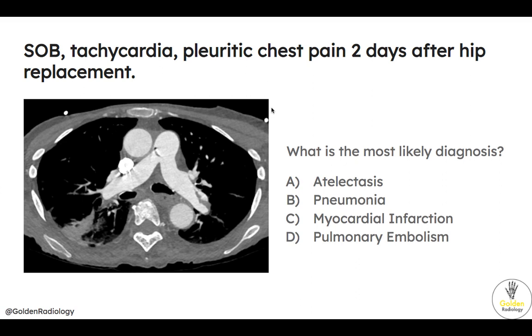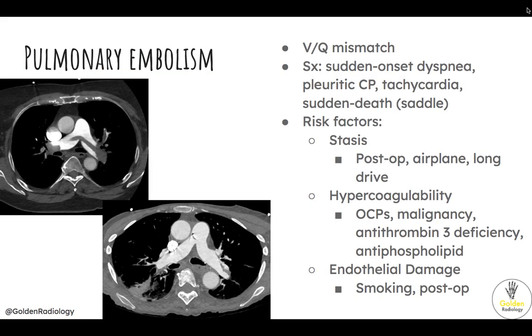Here's another pulmonary embolus with a slightly more subtle imaging and clinical presentation: shortness of breath, tachycardia, pleuritic chest pain two days after hip replacement. On CT, we see a little bit of thrombus here and here. Rather than a saddle PE, this would likely be a lobar or segmental pulmonary embolus. We also see parenchymal changes likely representing infarcted lung tissue. Pulmonary embolism leads to hypoxia by causing a VQ mismatch — Q (perfusion) decreases while V (ventilation) remains the same. Clinical symptoms include sudden onset dyspnea, pleuritic chest pain, tachycardia, and sudden death, particularly with saddle pulmonary embolism.